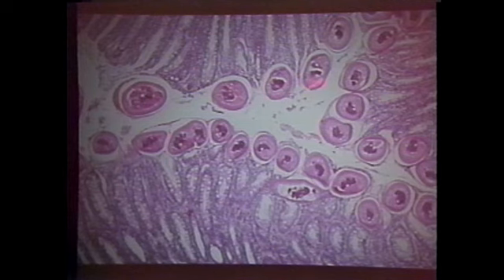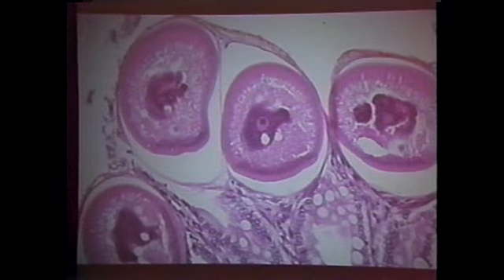This is Trichuris in a dog. Remember, there's two parts of the body in Trichuris. There's the little small anterior end and the very thick posterior end. Now, Trichuris, not all aphasmids, have a structure that none of the other ones have, and that's a bacillary band.